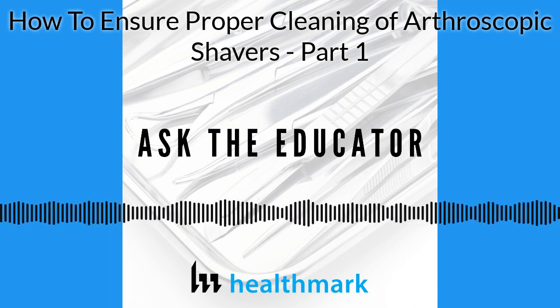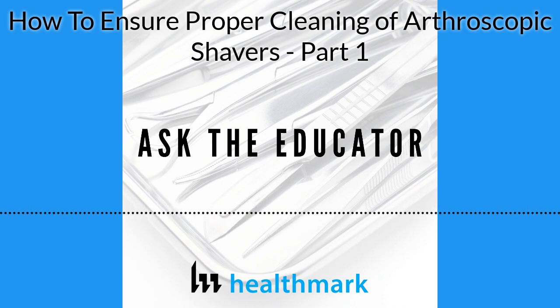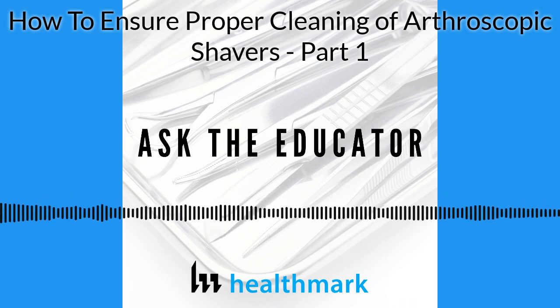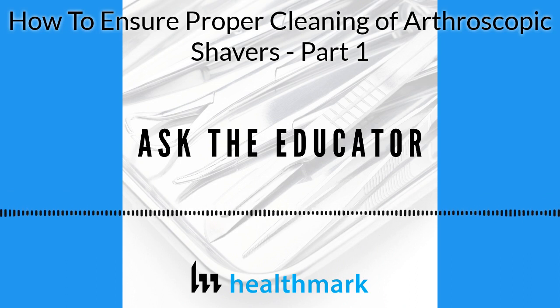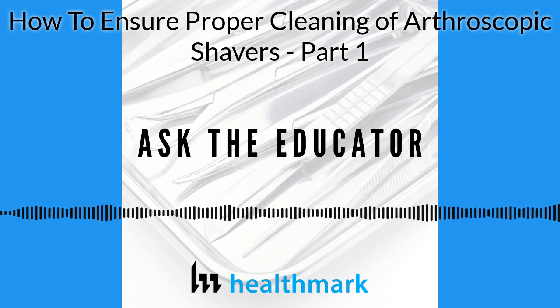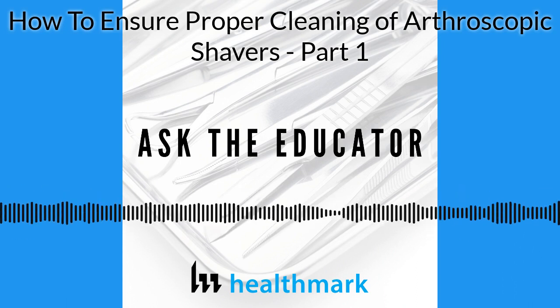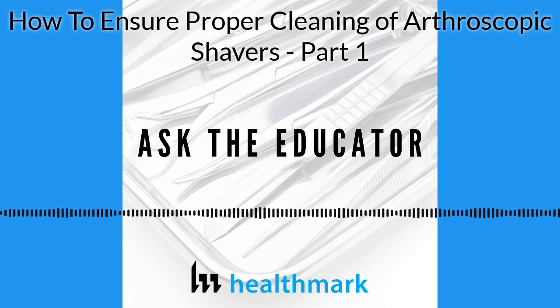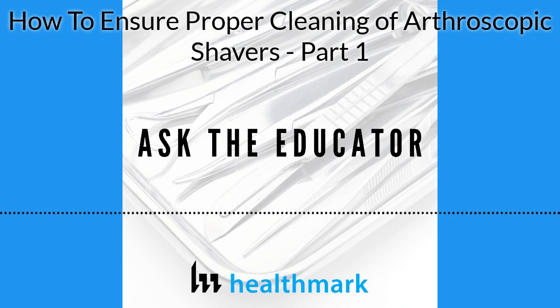And for us to hear that there are places that still don't have a borescope, and it's not just the arthroscopy shaver. There are micro abraders and shavers that are out there that are very similar, that are used in neuro and other places, that I believe when you read the IFU, it'll say inspect. Visual inspection, both internally and externally, is important. I know we're just talking about the shavers, but it can go to other things.